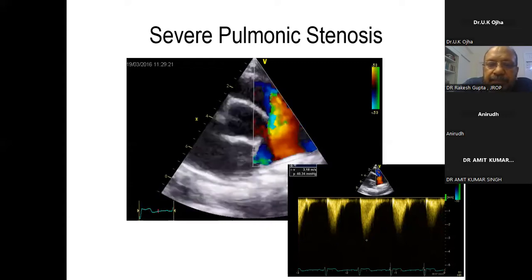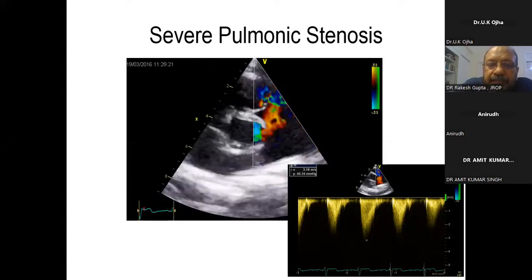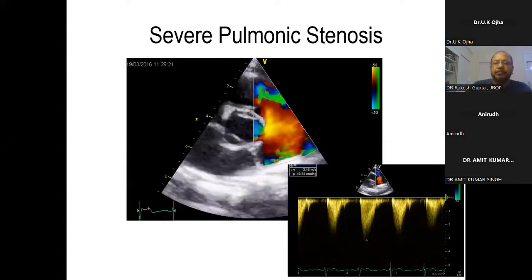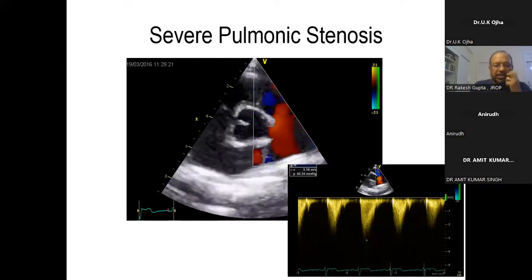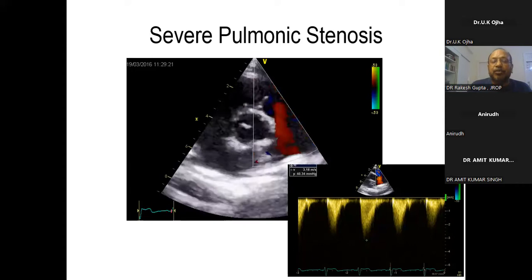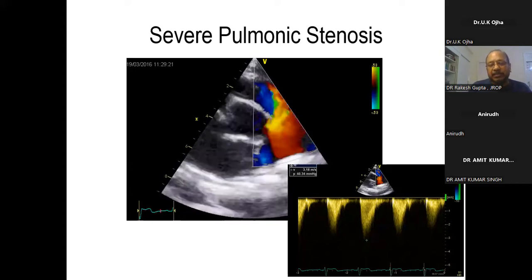Yes, Pooja, go ahead. Is there a role of measuring the thickness of the pulmonary valve, sir? No role. And doming? No role. You can say thickened and domed. And as a principle, thickening is any valve more than 5 millimeters of thickness. Okay, thank you.